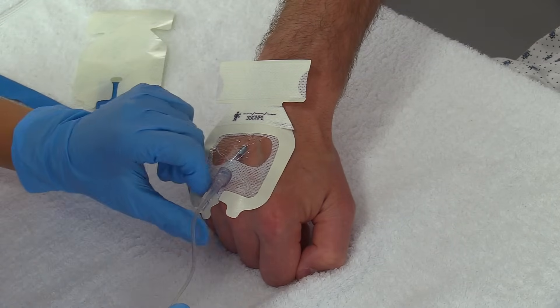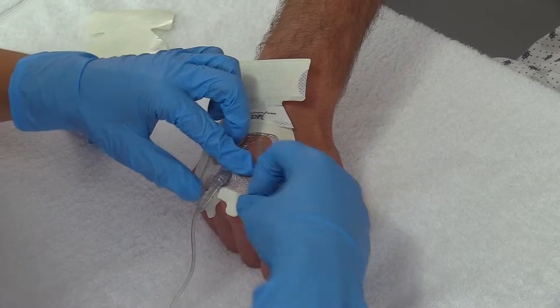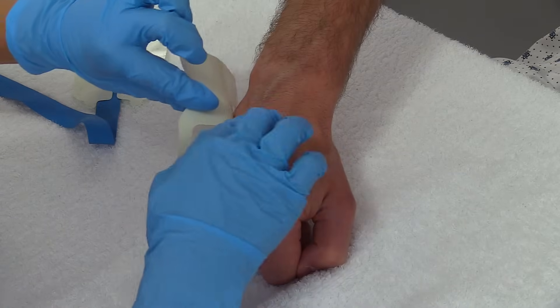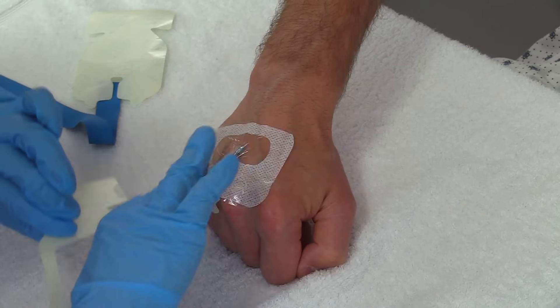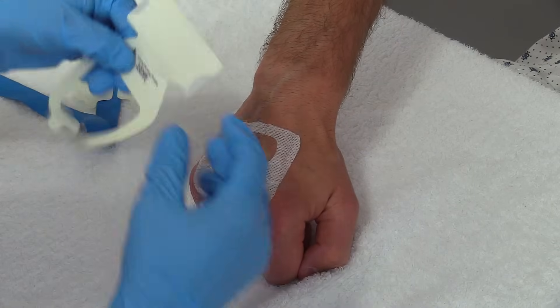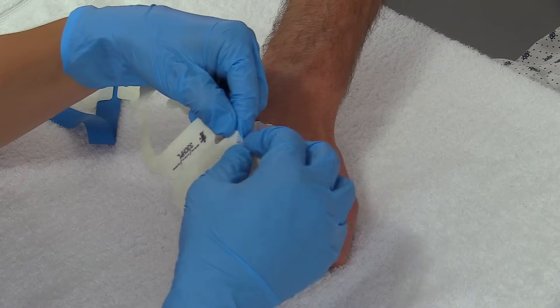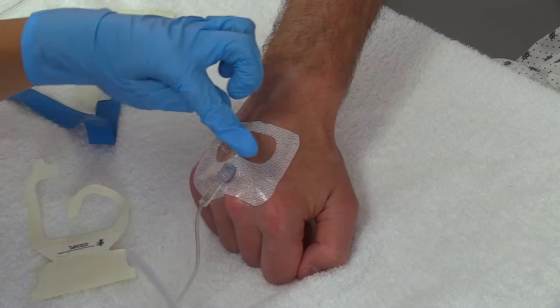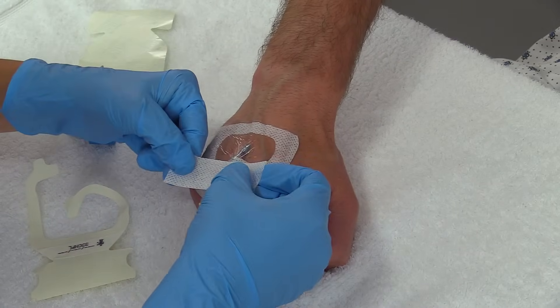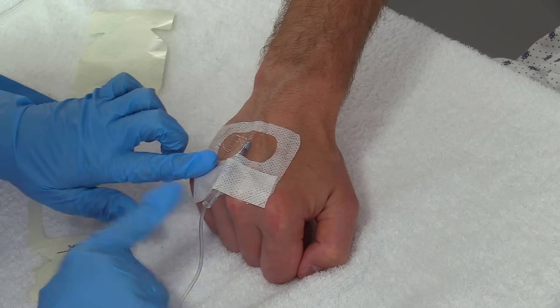Then I'm going to tear off these edges around the IV — these little edges. As you're doing that, just push it down and make sure it sticks to the skin because you don't want to lose your IV after you've started it. Then I want to take this big piece of tape and lay it across this part, which just provides extra securement. I'm applying pressure and sealing it down — nice and sealed.